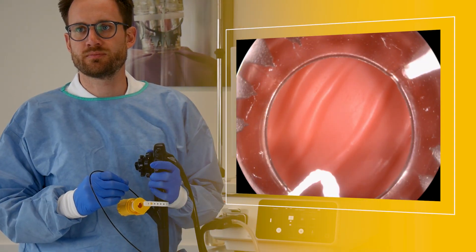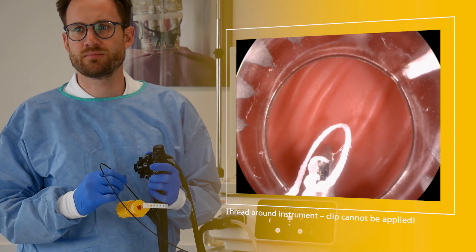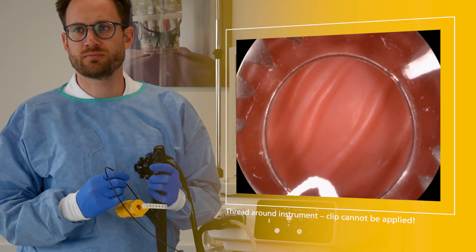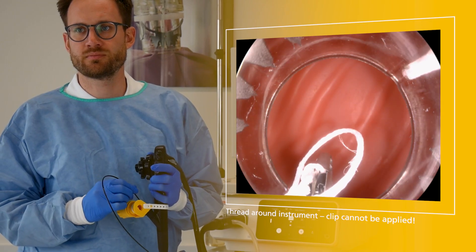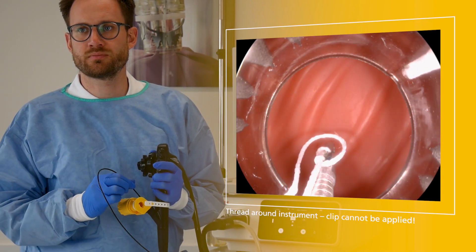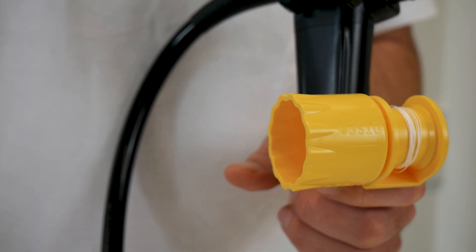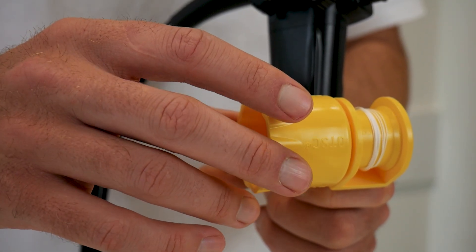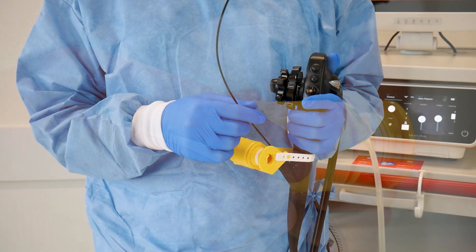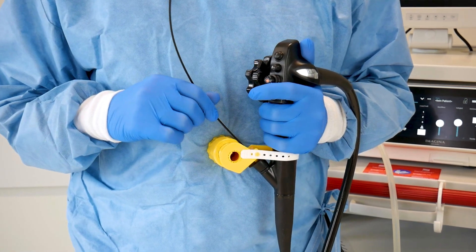When introducing an instrument, the release thread should remain slightly tensioned to prevent it from wrapping around the instrument and hindering or impeding clip application. Therefore, before introducing the instrument, turn the hand wheel clockwise until slight tension is felt and press it against your body to prevent the thread from unwinding.